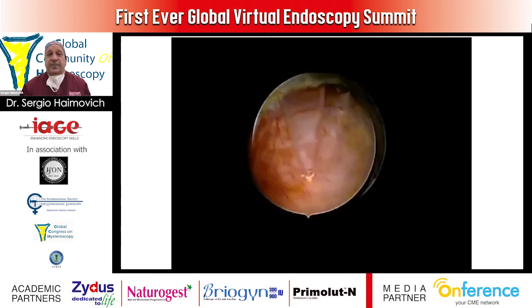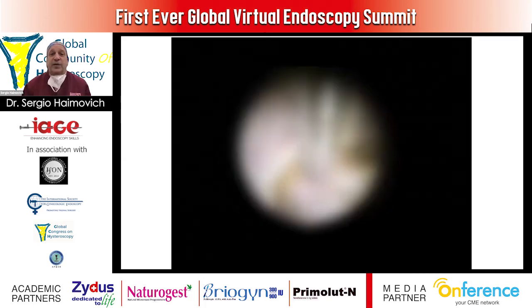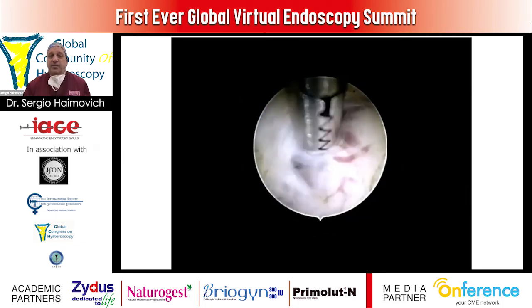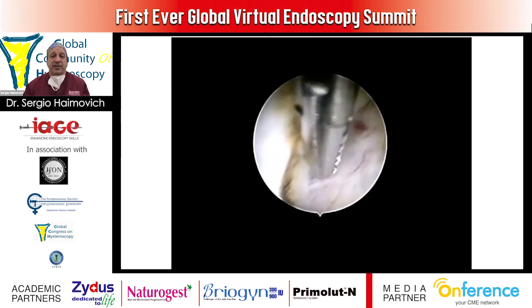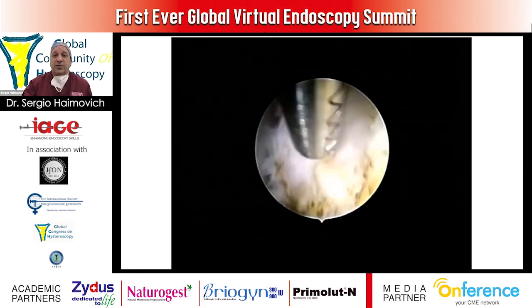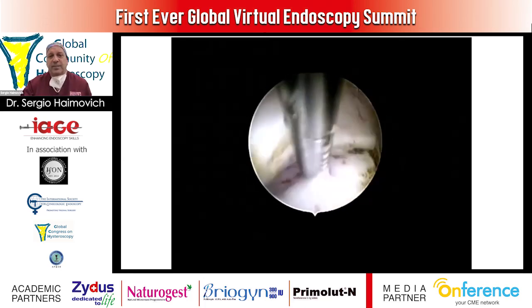That's the next step, with a grasper. You don't need more than a grasper the moment you have it open. And you try here, no, it's not here. And then you try here, oh, it goes in. That's the right place. And very easily, you can remove the fibroid. You can see it here. So that's the way to do it from my point of view, the enucleation in office in order to cleanly remove a fibroid from the wall, like in laparoscopic myomectomy.